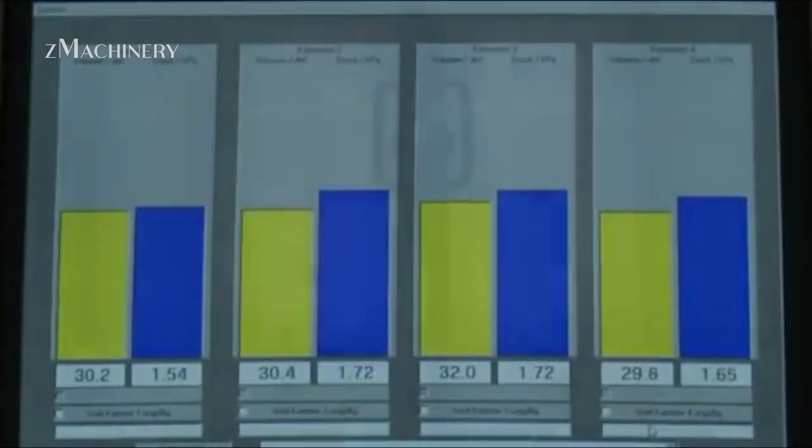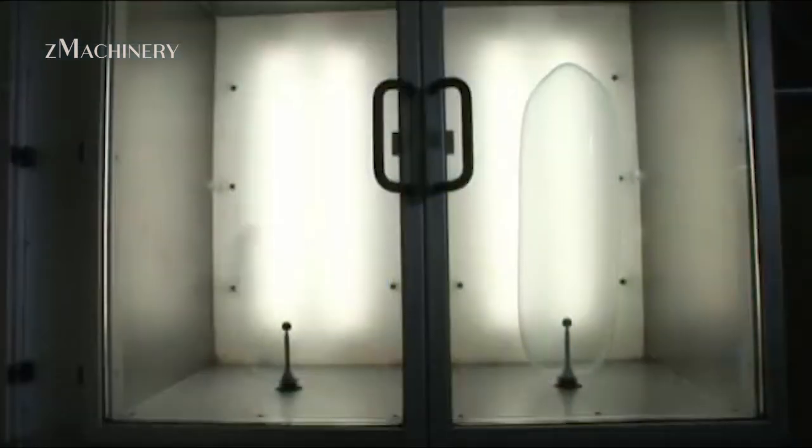Some are filled with water or air and checked for leaks or bursts. Only those that pass all tests move on to the final stage.